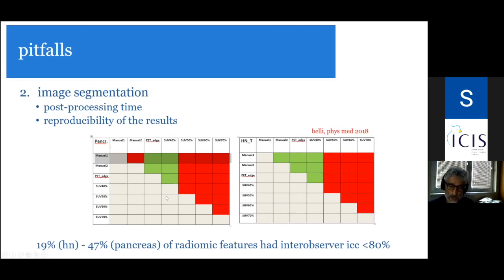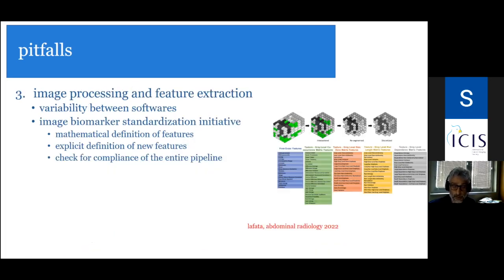So this is why most of the literature seems to orient toward the fact that in the future, deep learning will be the most effective way to segment images. But of course, this has a drawback. If deep learning is going to do this, probably our role as radiologists will be diminished.